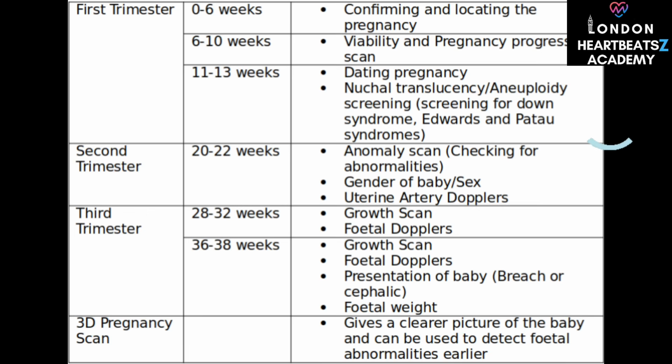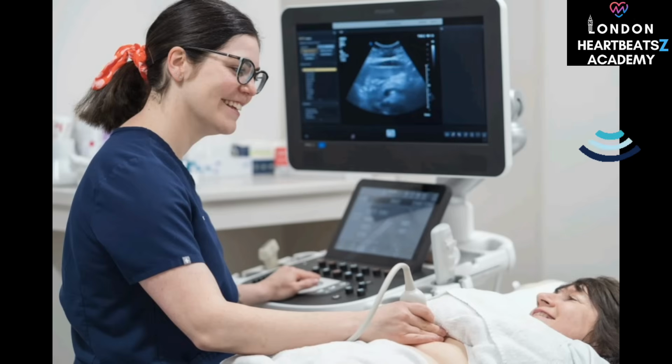Ultrasound is widely accessible in many healthcare settings, often much more so than MRI or CT. It's relatively low cost compared to those other modalities. Modern ultrasound machines are often portable, making them versatile. And generally, these scans don't require sedation for the patient, which is a big plus, especially in pregnancy. These are the very reasons why, as sources discussing even neonatal cranial sonography point out, ultrasound is invaluable: easy access, low cost, portability, no radiation, no sedation. It translates directly to why it's the workhorse for prenatal imaging. It makes perfect sense. Safe, accessible, real-time imaging.